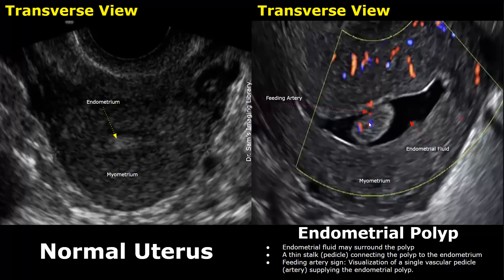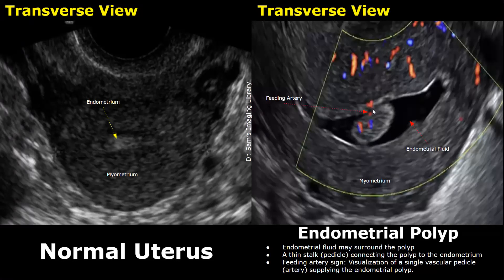Color Doppler is applied. Color Doppler features are very helpful in distinguishing a polyp from other uterine masses because a polyp will usually have a feeding artery which can be seen on color Doppler. We see a linear structure filled with Doppler signals referring to the feeding artery — a single artery entering the polyp from the endometrium. This single linear vascular structure is the feeding artery sign, and the point where it enters the polyp is usually where a thin stalk connects the polyp to the endometrium.